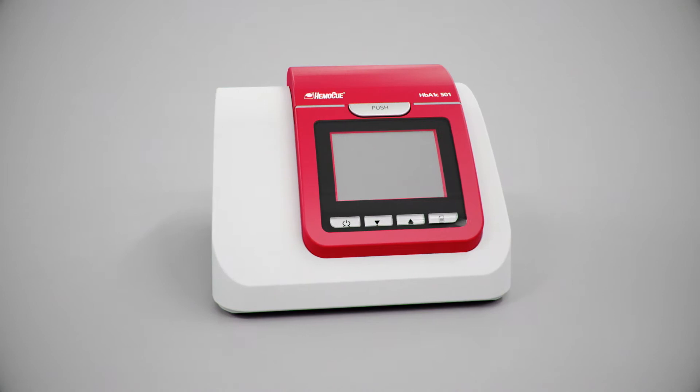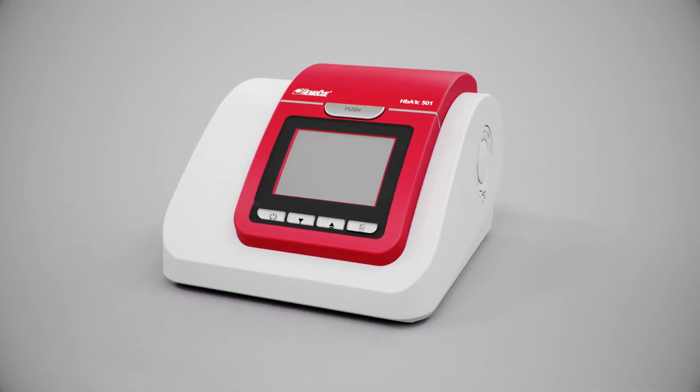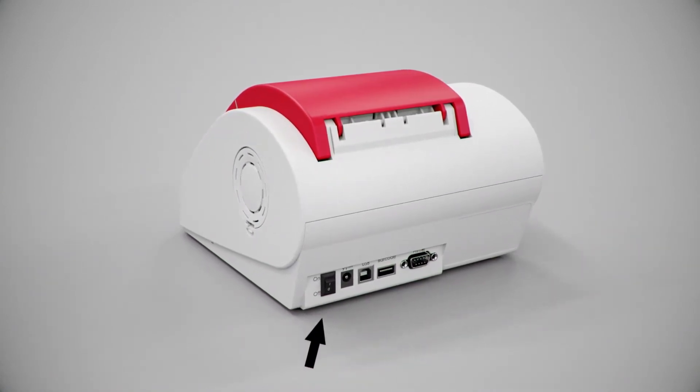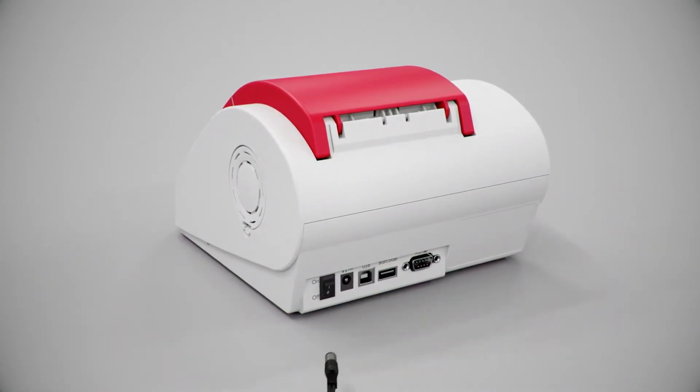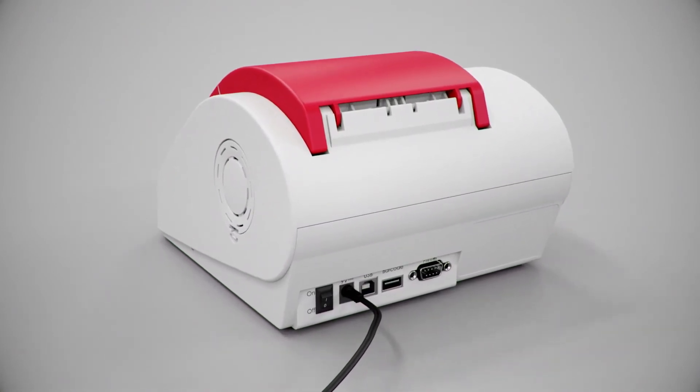Startup. Make sure the analyzer is placed horizontally and on a stable surface. Ensure that the analyzer power button is off and the lid is closed. Connect the power adapter to the analyzer to an appropriate grounded AC electrical outlet.